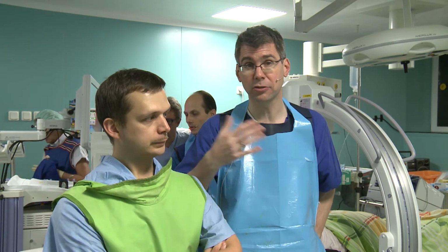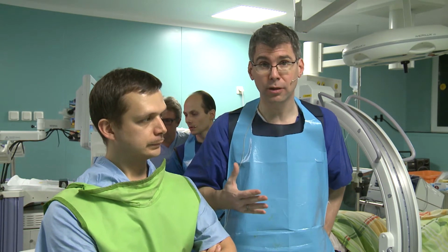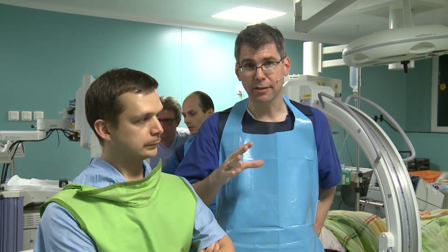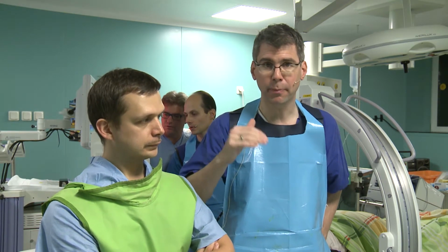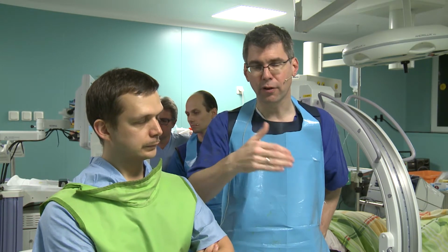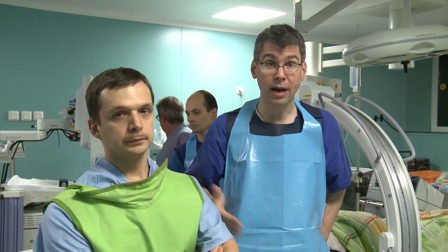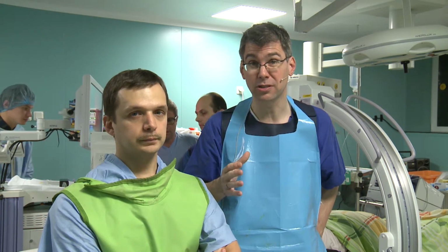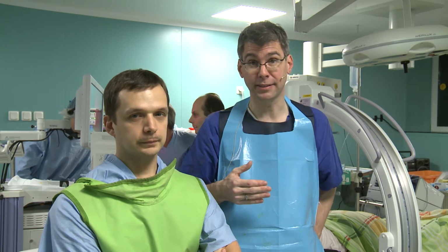And when I see that the stricture is responding to balloon dilation, I would repeat this twice a year, as long as the stricture is not a problem anymore. And then the patient goes back to MRI diagnostics for the following years, until in MRI there is another stricture, for example, which is suspicious of malignancy. Then the whole thing starts again.